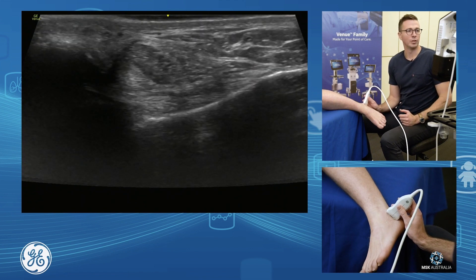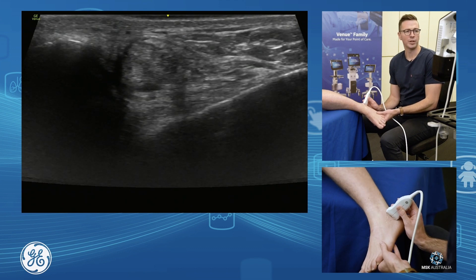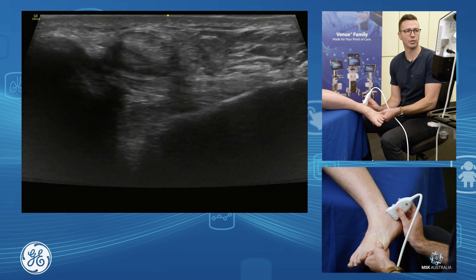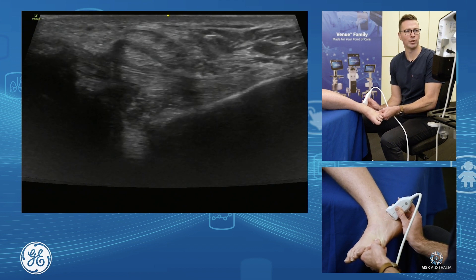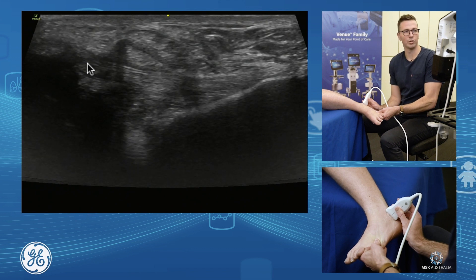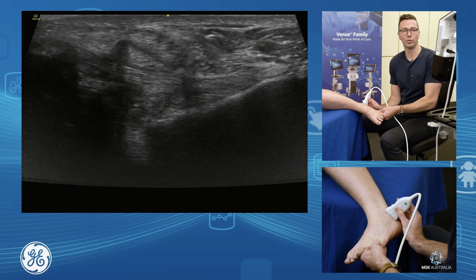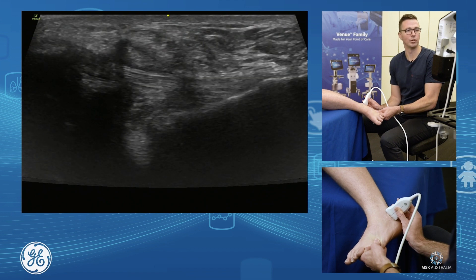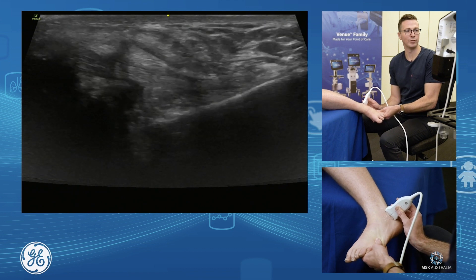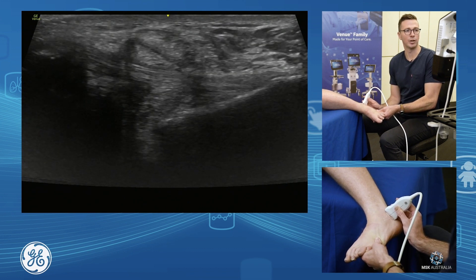We grab our peroneals and find our calcaneofibular ligament. Now to put this on tone, we need to invert the foot a little bit and add a bit of dorsiflexion to stretch it out. We can then see quite nicely our calcaneofibular ligament through here. Think about how you injure your calcaneofibular ligament - it's a dorsiflexion inversion injury, so you need to put it on tone the same way: inversion and dorsiflexion. We can see our fibular end and our calcaneal end very nicely.